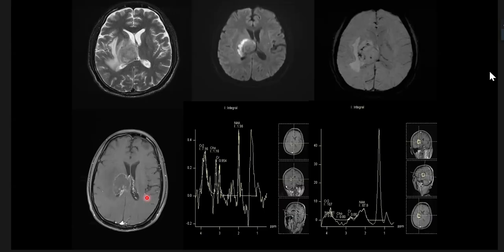Very good. Enhancement will usually be homogeneous. I'm saying that this patient is immunocompromised. Then lymphoma is a possibility, sir. Okay, how do you rule out that this is not a lymphoma? I'm telling this is not a lymphoma. And if yes, you have to tell what is the positive finding for lymphoma, and if not, why not?